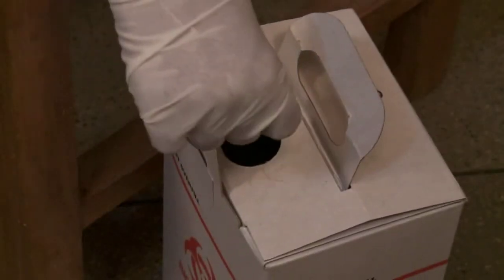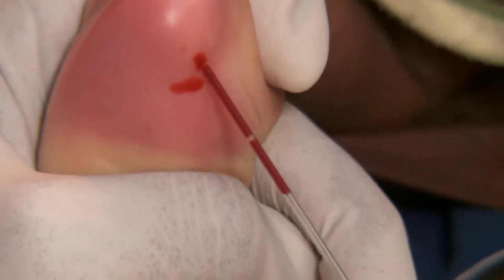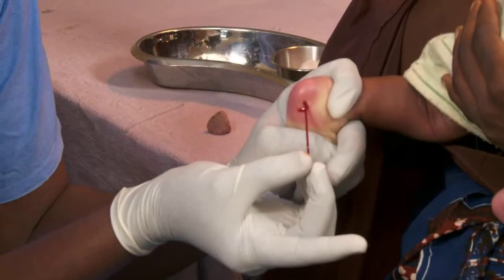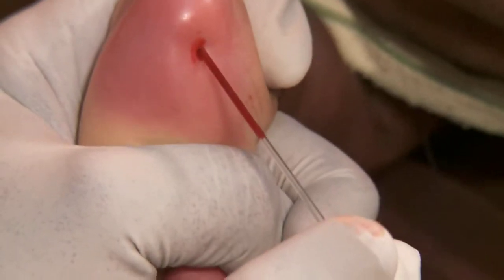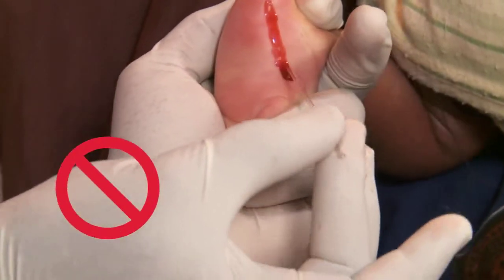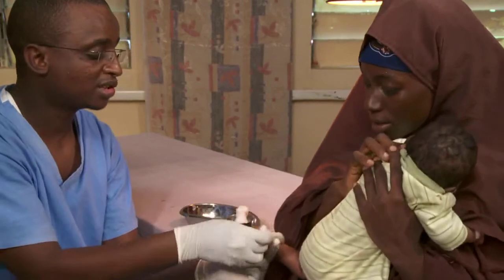Then puncture the side of the heel firmly. Safely dispose of the sharp. Hold the tube to the blood to fill. If blood is slow to come, squeeze the heel gently and intermittently, but not too much — that can prevent accurate results. When done, apply gentle pressure over the puncture site.